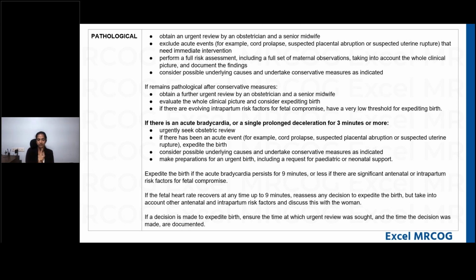Okay, so that is another important point when you're interpreting a CTG for bradycardia per se. You have to look at the maternal pulse. Okay, and that is also mentioned at every point in the guidelines, that you need to check if the maternal pulse and the fetal heart rate are coinciding, because sometimes the CTG probe may pick up the maternal rate rather than the fetal heart rate. Okay, then these other points are the usual points.